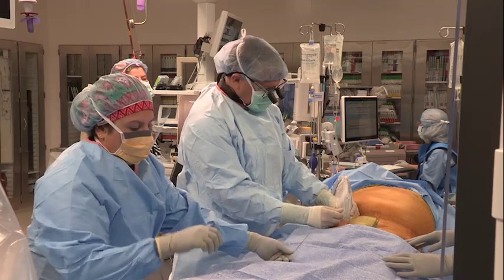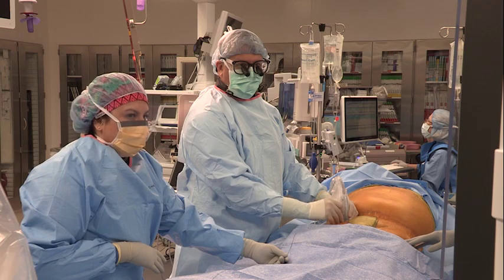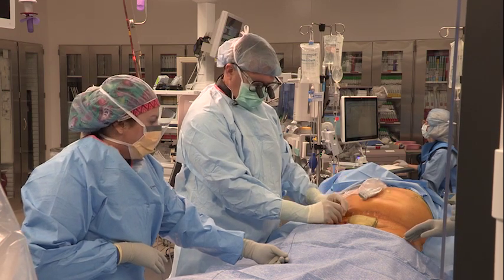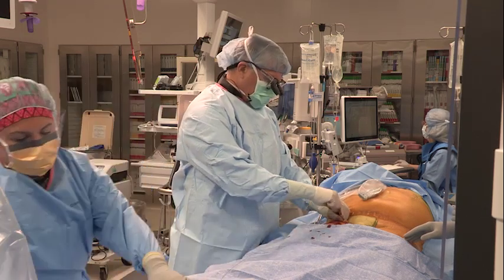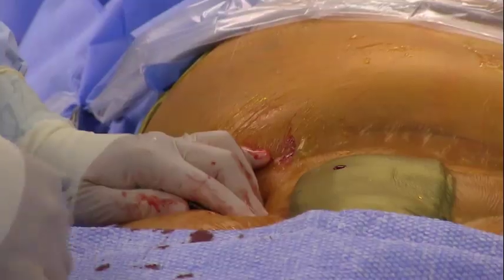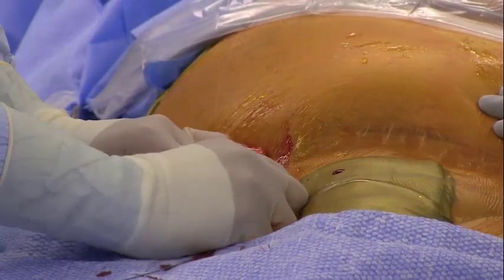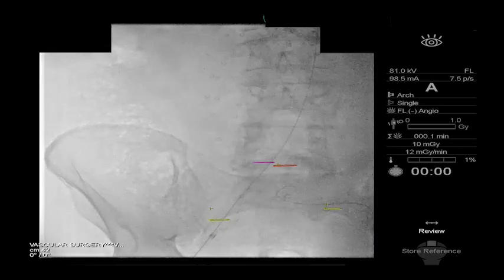Administer local anesthesia by injecting lidocaine under the skin and in the adventitia around the artery. Then obtain access with the 21-gauge introducer needle. Place the 0.018-inch guide wire with standard Seldinger technique. Next, perform an angiogram to confirm artery access.